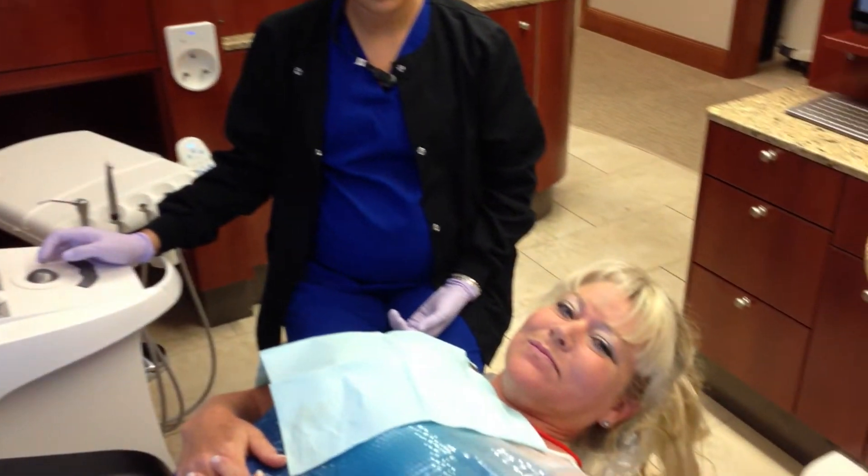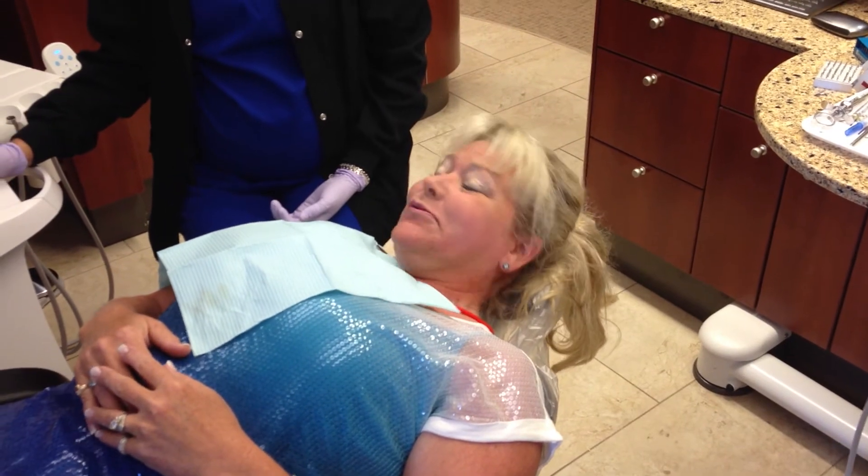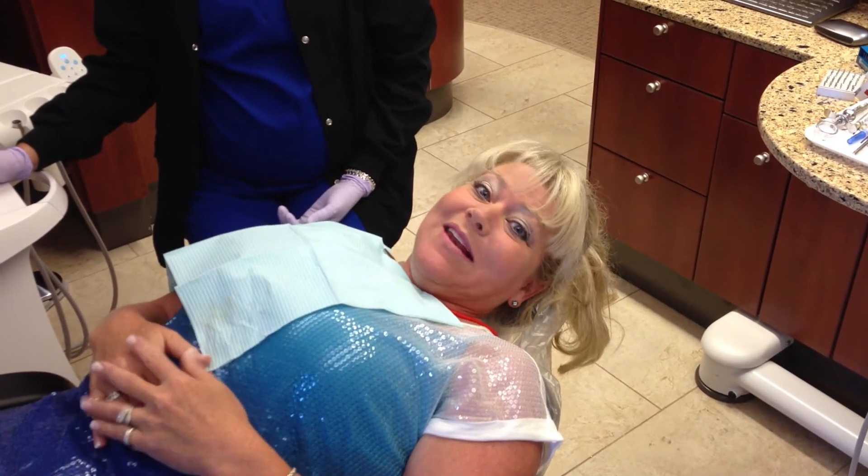Hey Connie, you've had impressions taken before. Compared to the old way, how's this working for you? This is real nice, very precise, and no pain at all.